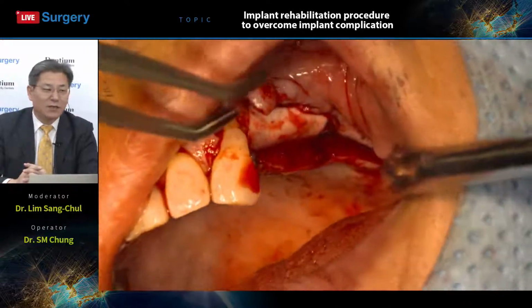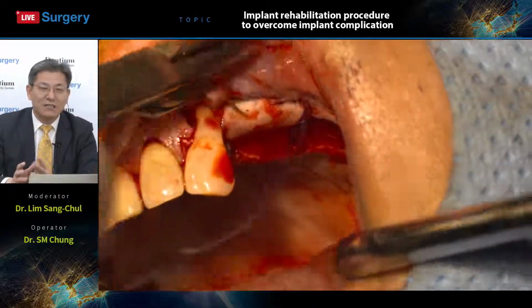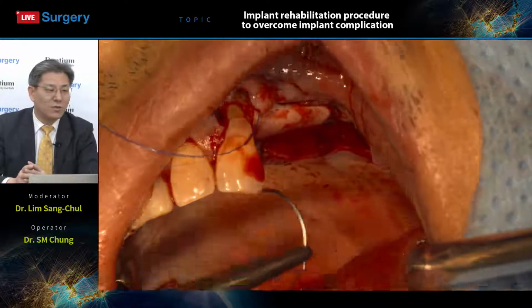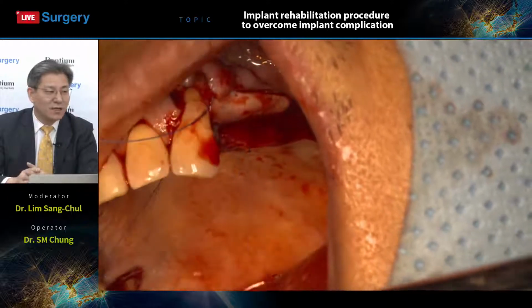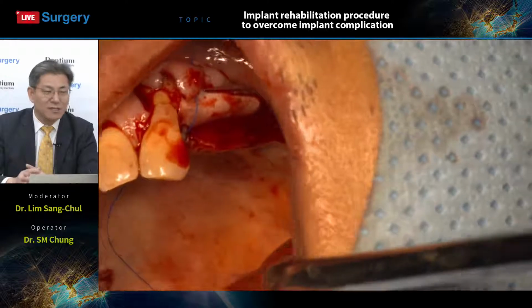replacement for occlusal loading, as you know. So connection is an important part, important factor for longevity of implant, as you know. So this 10 degree connection is unique of Dentium. So they launched it as a brand new system, the Bright system.